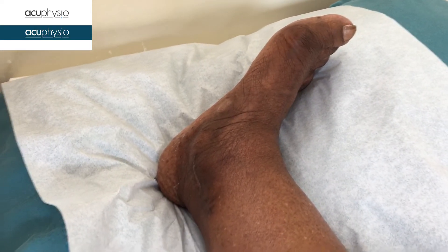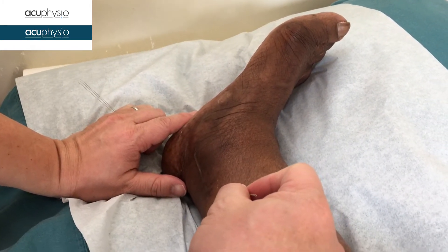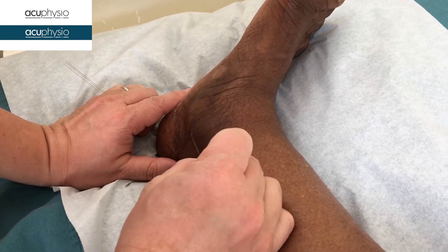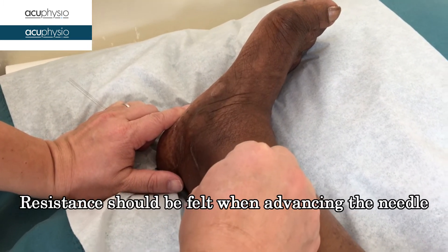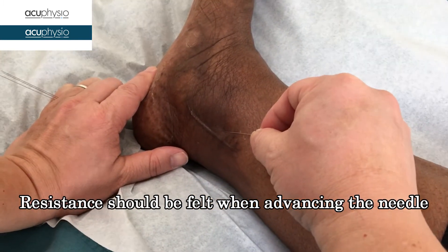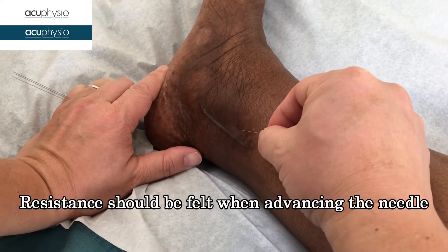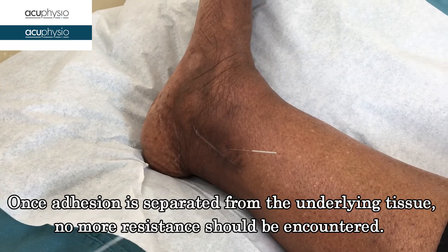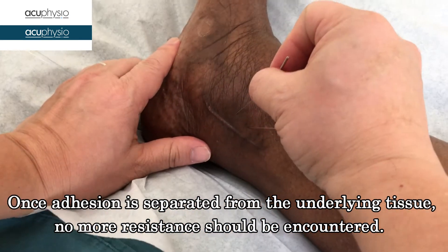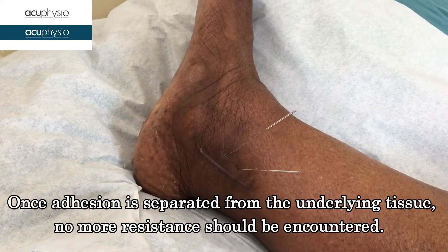This is a scar status post surgery, and the patient has pain around here. I'm going to use the needle to deactivate the trigger points around the scar tissue. You put it in and you're going to encounter some resistance in the scar. All you need to do is move in and out until you feel the release of tension, then keep the needles there. With this kind of treatment, it usually takes about three to four times and the pain around here should disappear.